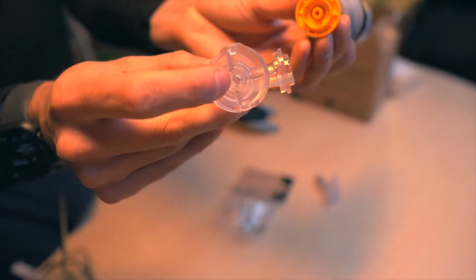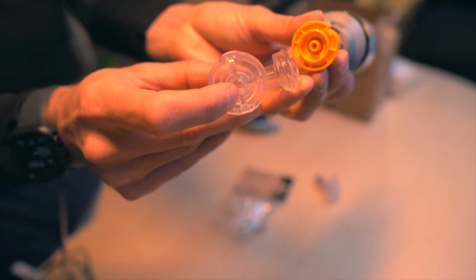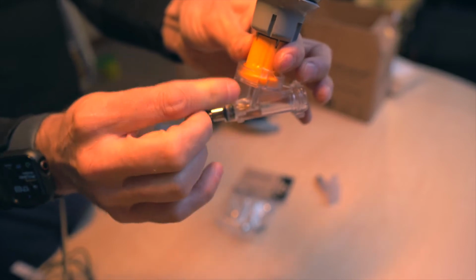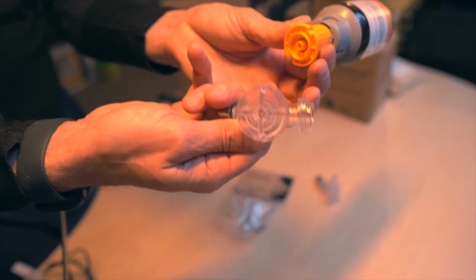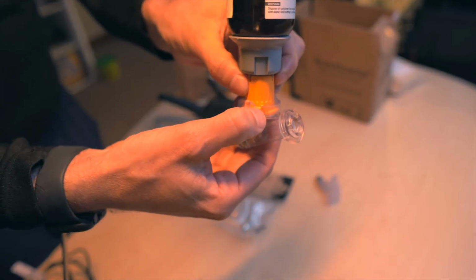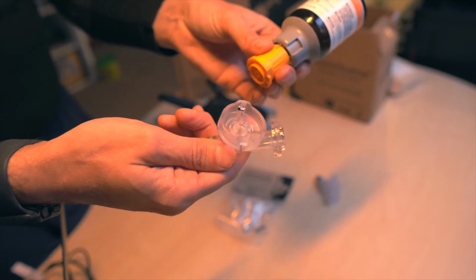Now, as there are multiple bottles being replaced here, there might be some wear that starts to occur on the inside surface of the barrel of the fluid junction. Allowing some play and some extra tightening to occur here means that as that wear occurs on the inside, you can replace multiple bottles and still get a reliable, good seal. So the tip is just tighten it up so it's firm, thumb and forefinger tight, but you don't have to go right the way to the hilt each time. And that will help prevent cracking, and it'll also make it a lot easier to take off each time.